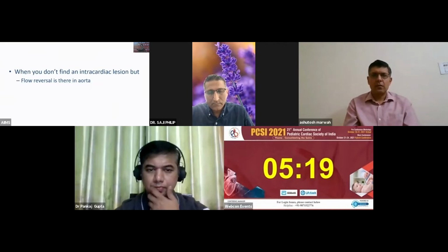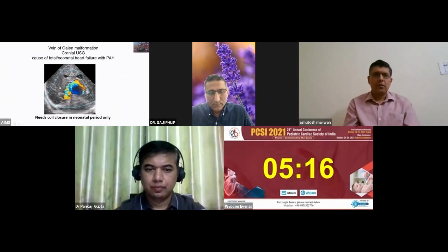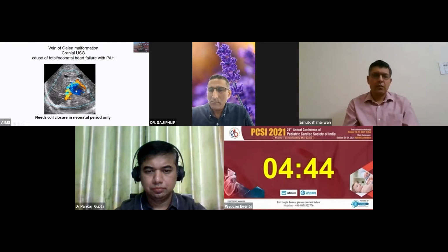extracardiac causes for it. And this is a newborn, a small infant presenting with these features, meaning CHF, PH, features of flow reversal in the aorta, nothing intracardiac. As a policy, you have to put your probe over the head and over the abdomen, over the liver. So you need to rule out extracardiac causes leading to runoff lesions. And this is a newborn with a large vein of Galen malformation. A pulsatile vessel, a large shunt is seen into the cerebrum, and the child underwent coil closure in the neonatal period.